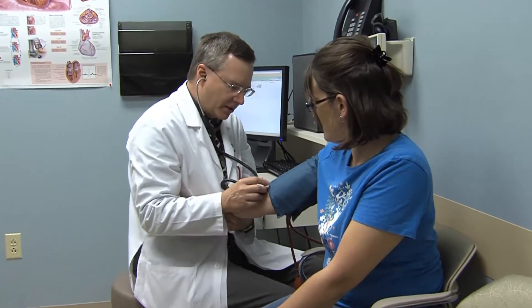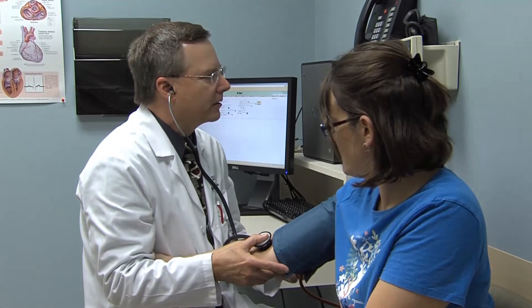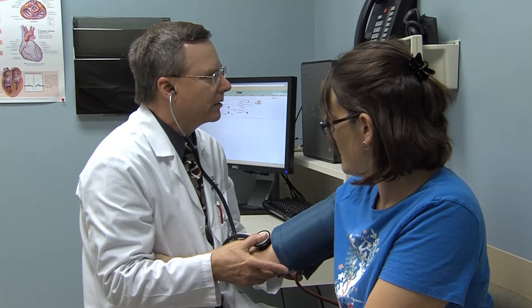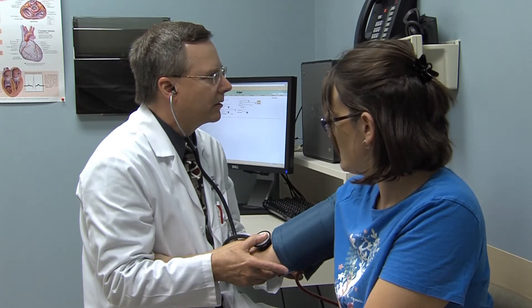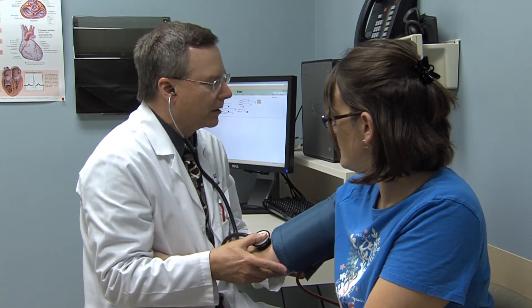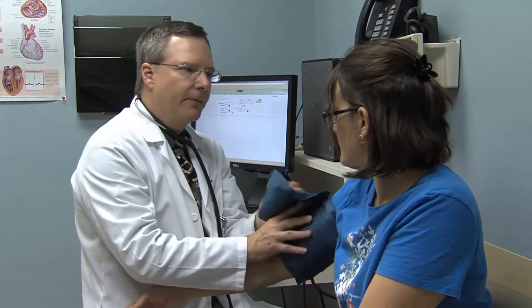So let's just check and see what your pressure is this morning. Your blood pressure is 106 over 60. That's very good.